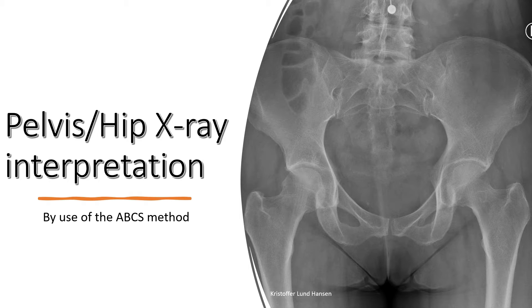This video will teach you how to perform a basic interpretation of a pelvis/hip x-ray. We will use the ABCS method, which I will explain shortly. I like this method as it includes the important parts and it is easy to remember.